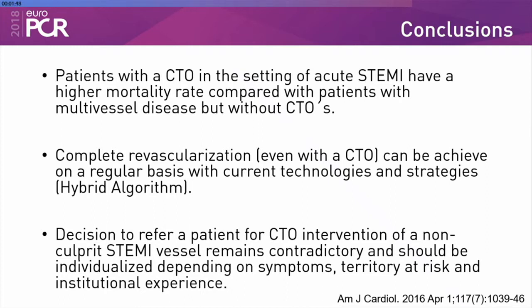It just depends on the lesions. I mean, not every lesion is simple, and it depends on how much dye you've used in that procedure. So you have to individualize. Okay, that's a good point.